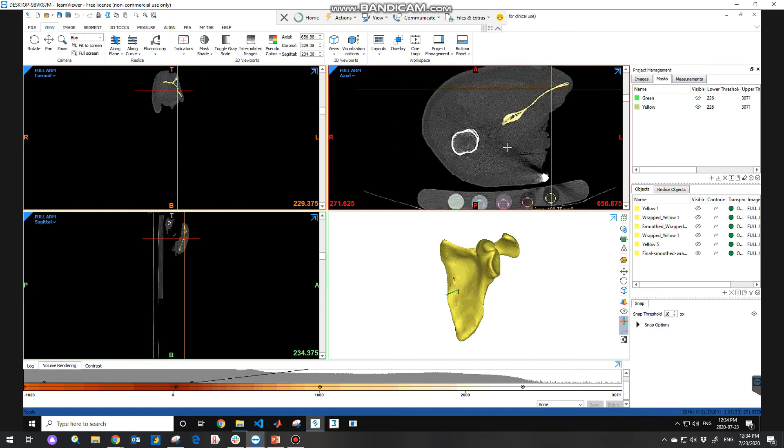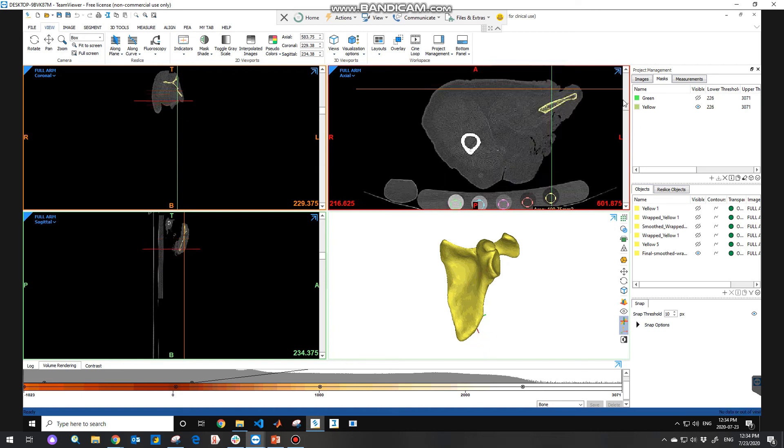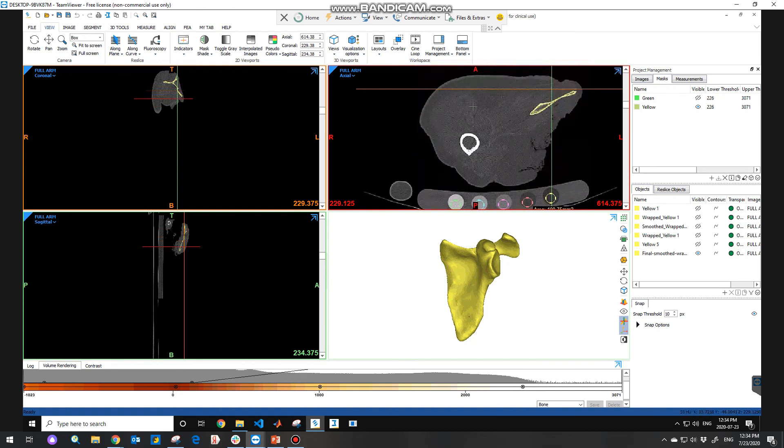To navigate to images, you can use the sliders on the right or you can scroll with your mouse.